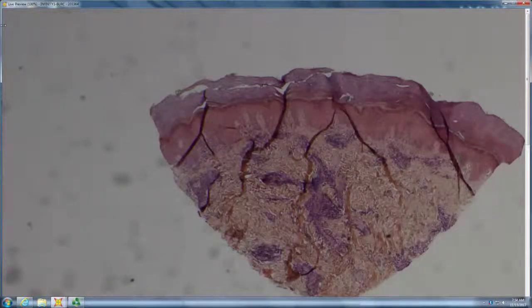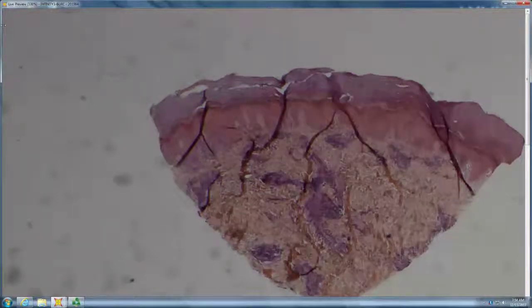This thing kind of fell apart a little bit. Yeah, not only that, but it's like someone was really enthusiastic with their forceps. It's like some cannonball angioplasia. Maybe. There is some cannonball angioplasia, making you think of stasis dermatitis. Yeah, at least you're on a shin, probably, and it may well be stasis was the issue, which was, in fact, the history. Well done.